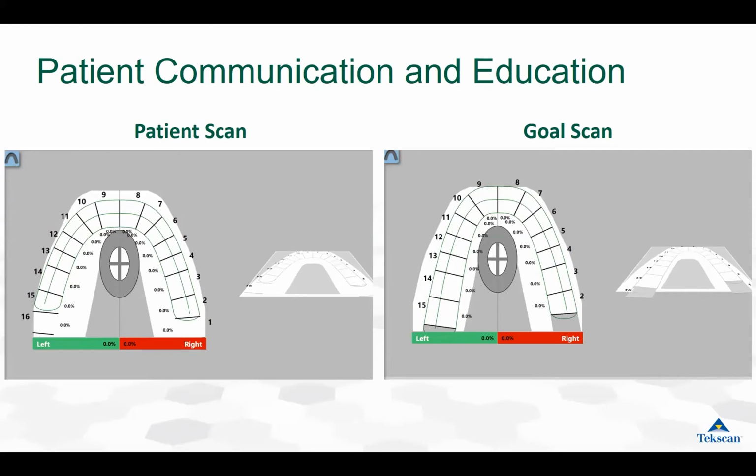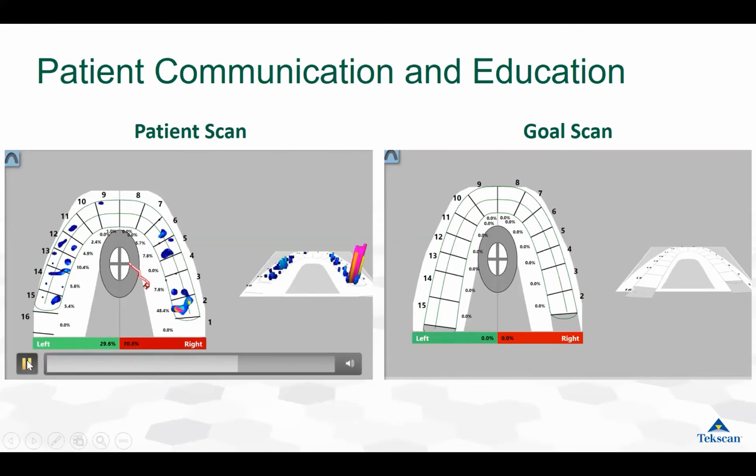It's very easy to capture with Novus Core and with Novus, and allows you then to take the next step with the patient and undergo any additional diagnostics that might need to happen. So let me play through this. So this is a patient scan, and you can see that similar to what you saw when I took a scan, the patient closes, and this is them just holding their teeth together.